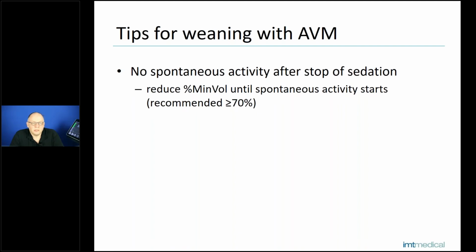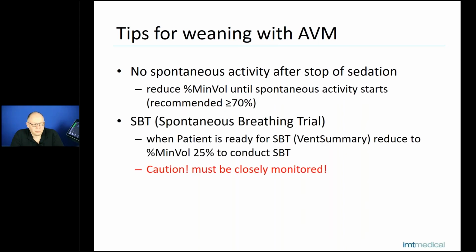If the patient is stable and is breathing spontaneously and everything is fine, it doesn't have to be 100%, 80% or 120%. It doesn't matter. As long as the patient is stable and fine, there's no use in saying, oh no, I want to extubate him and I'm still at 120%, I have to reduce the minute volume, this is too high. No, that's not the case. The spontaneous activity and the condition of the patient is not related to the setting of the minute volume.